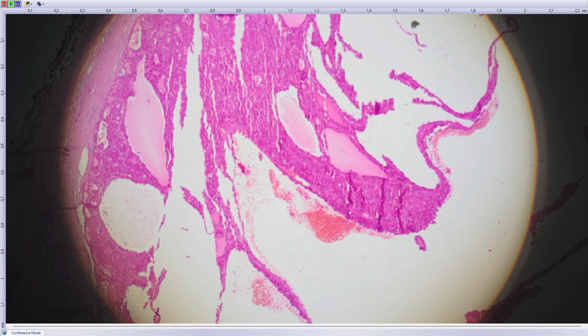So from the low magnification and from this basic histology, you can have some differential diagnosis, and the first diagnosis in the differential diagnosis is eosinophilic solid and cystic renal cell carcinoma. This is a tumor described, I don't know, 9 years ago by my colleague Andrea Hess here in Pilsen.